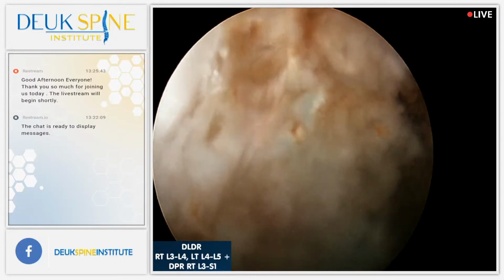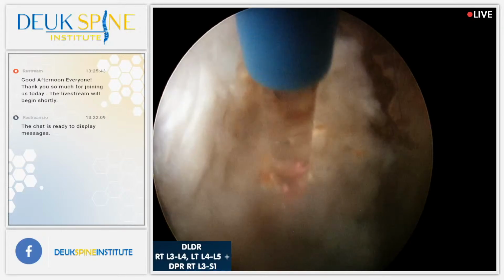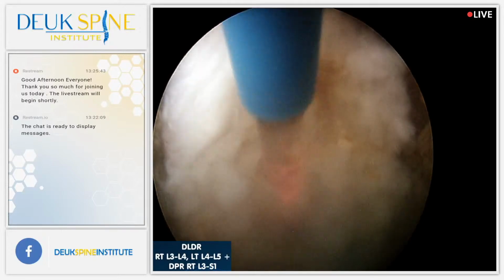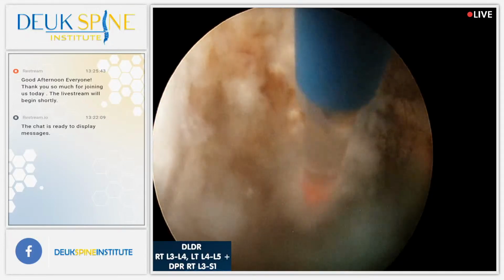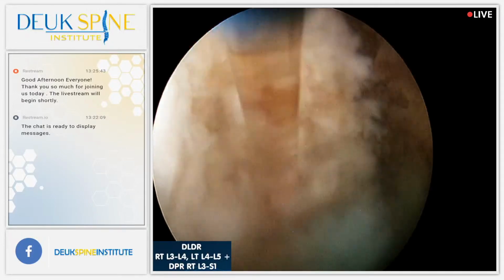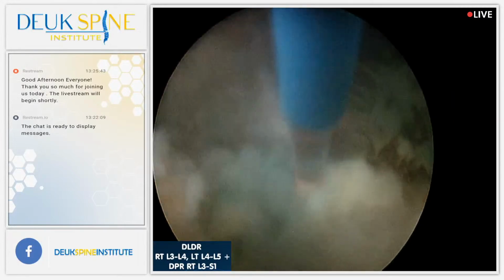Yeah, this fiber, because of the way the tip is, I think for some reason it's just not directing the laser energy as effectively. It's not bad. I mean, we're still getting it done. It's just taking a little longer. It's less efficient. You can actually cut across the glass fiber, right? Oh yeah, yeah. And you can.